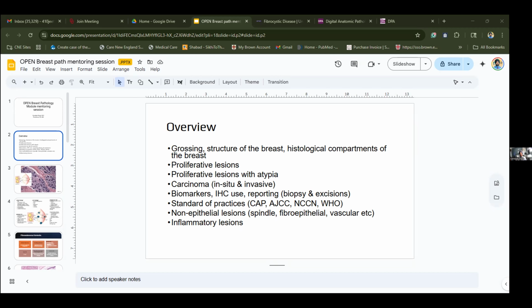You'll notice that in breast tissue, we will classify many breast lesions as proliferative, since the breast is a hormone sensitive organ, and the epithelial lining of the breast tissue undergoes hormone dependent changes.